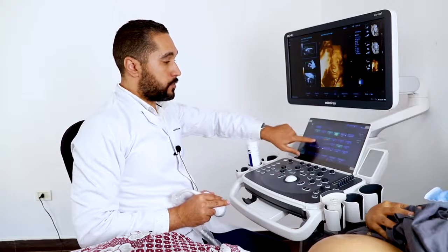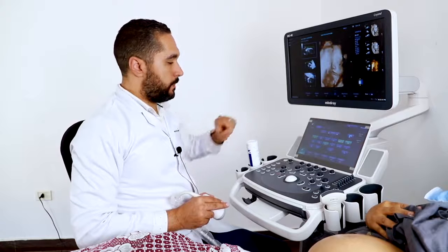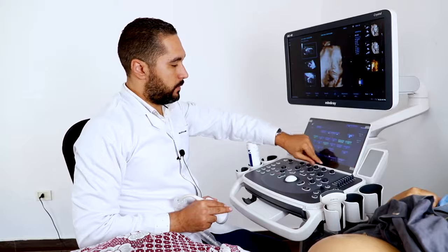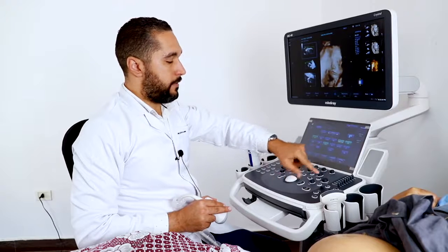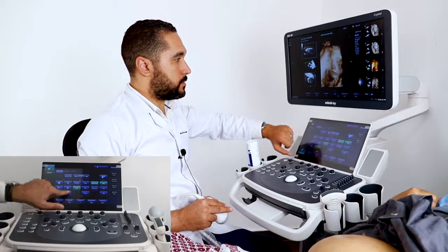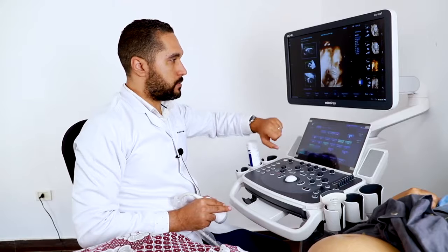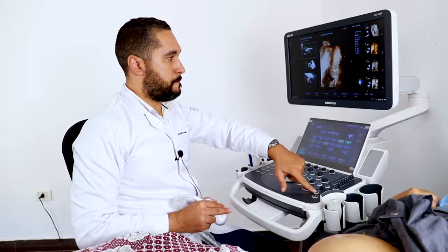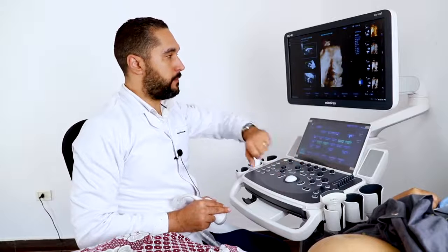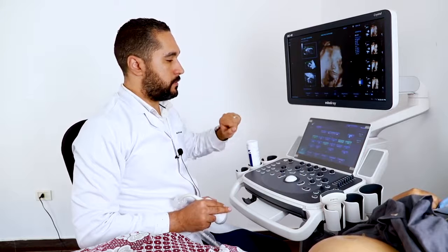Now I'm going to switch from the surface mode to the iLive mode. This is the iLive mode. We can also adjust the parameters. The iLive mode has a light source position — you can adjust the light source to get different view angles. You can save every angle of the light.